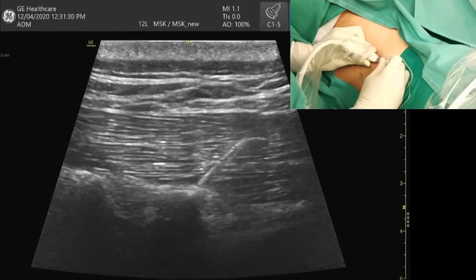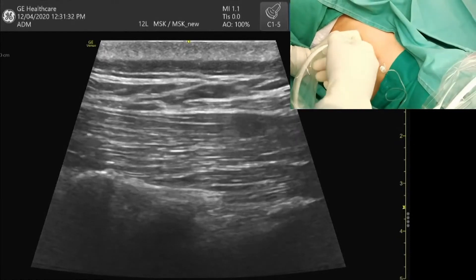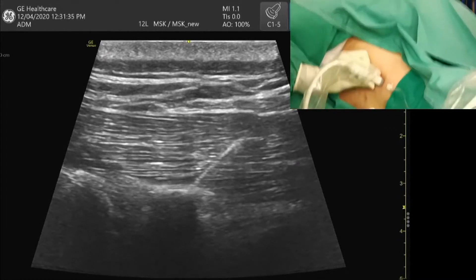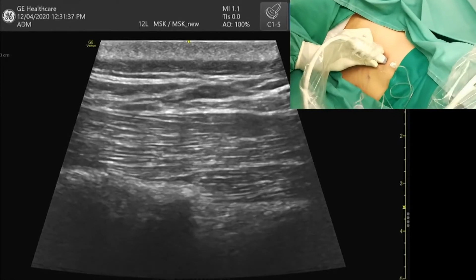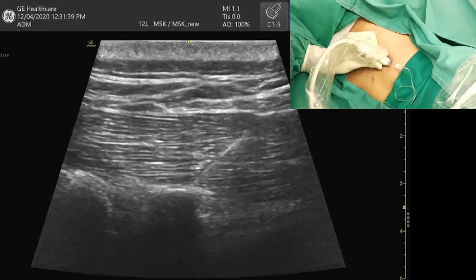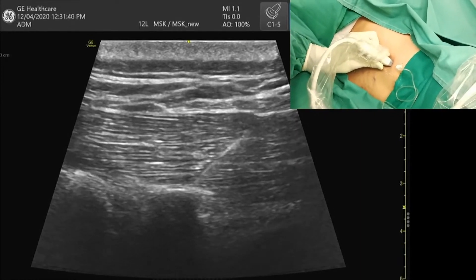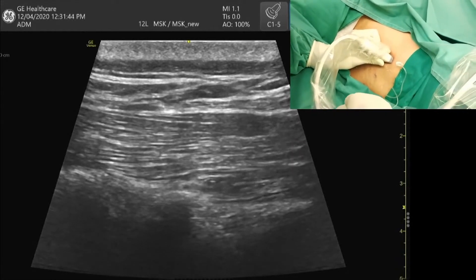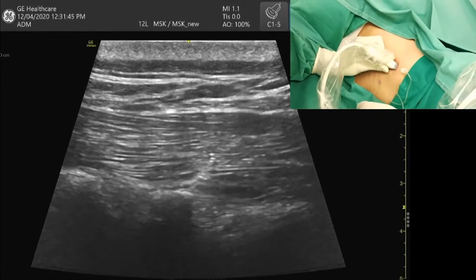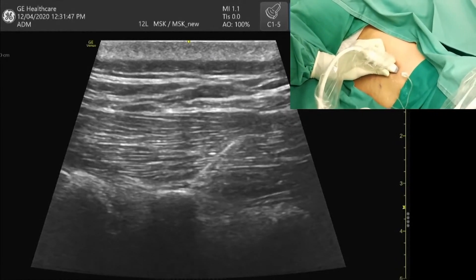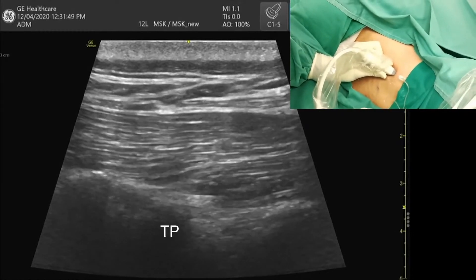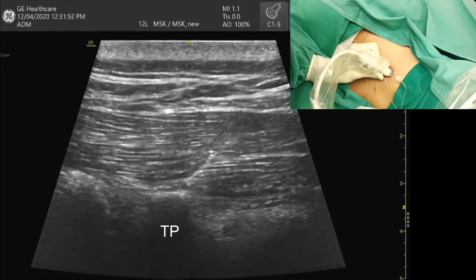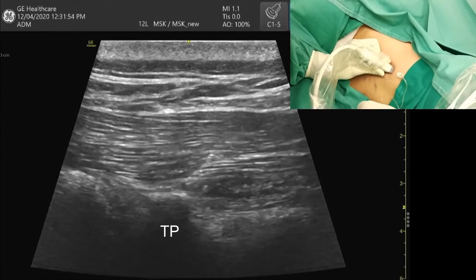You won't be hitting any vascular structure or the pleura. Now my needle tip is just above the transverse process. I'm going to start hydrodissecting by injecting local anesthetic. You can also use saline to hydrodissect if you cannot confirm the plane. As you can see, the plane above the transverse process is slowly expanding.